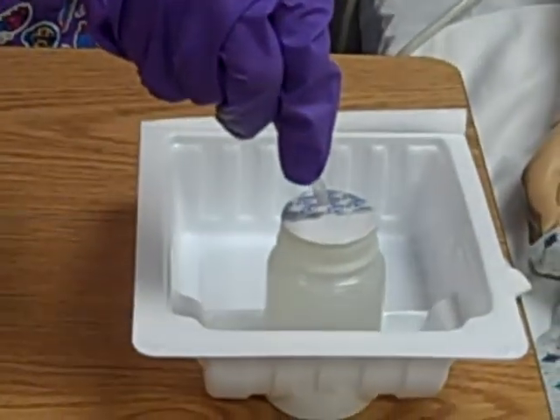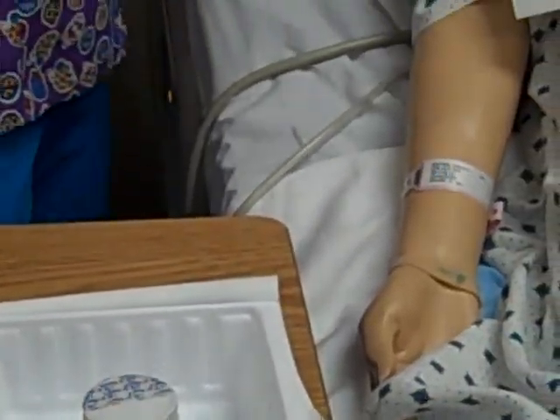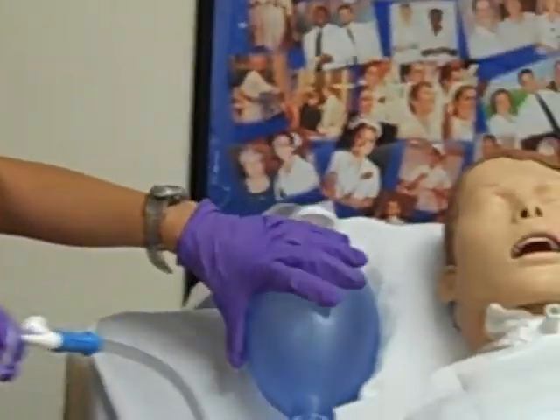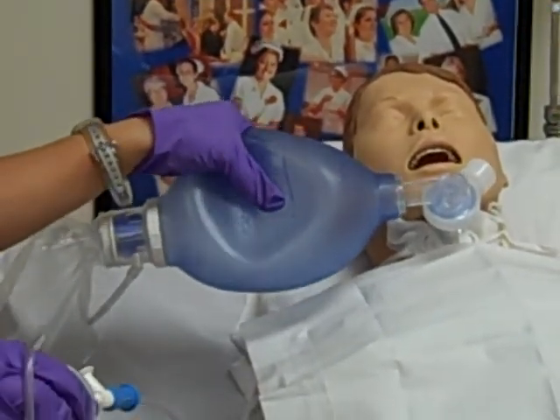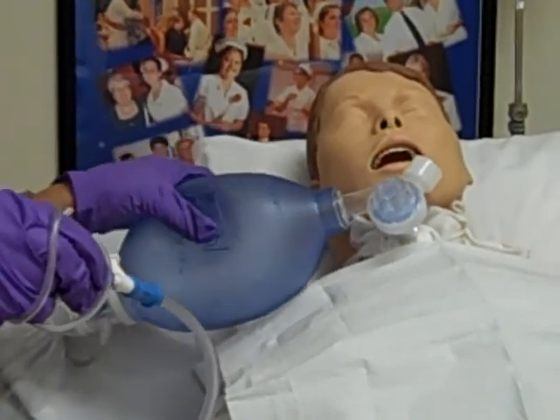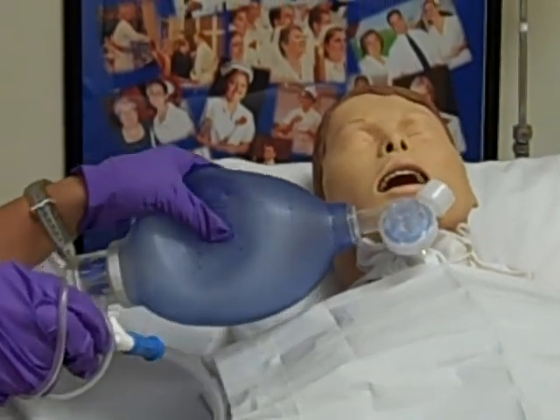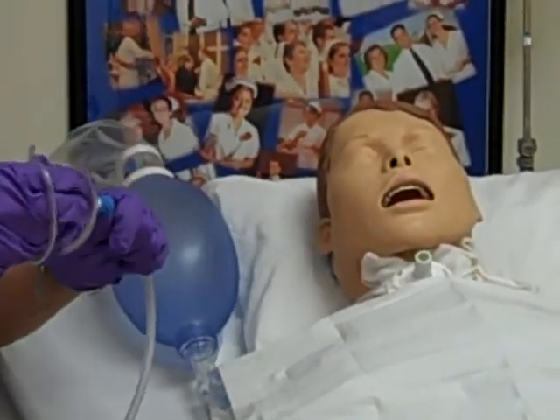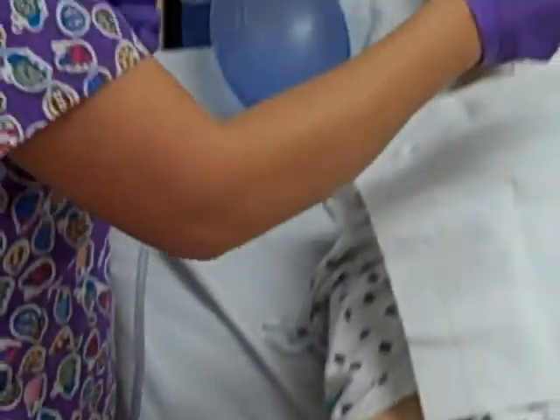I'm going to come over here and clear my catheter and the secretions. Notice that I'm not touching the unsterile portion. With my unsterile hand, I'm going to go ahead and hyperoxygenate my patient again in between each suction cycle. I want to give him a minimum of three breaths, or I can do this for up to a minute depending on how the patient is doing. Then unwind, re-lubricate, and go ahead and go in.